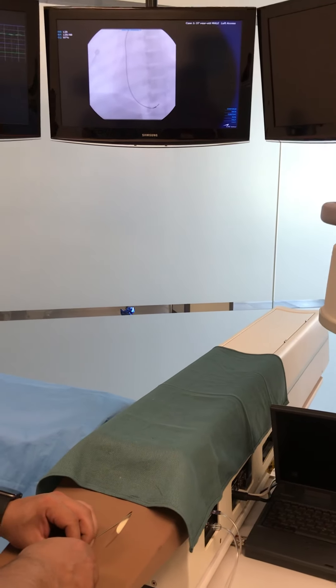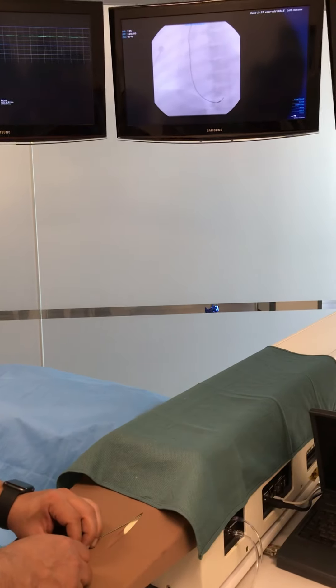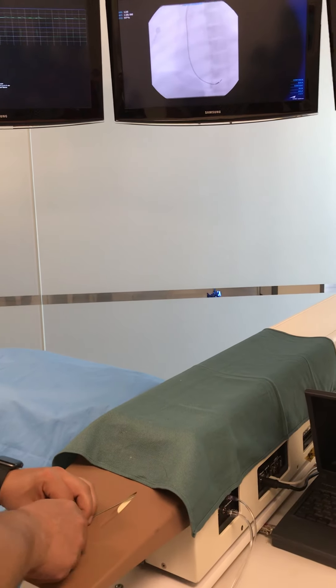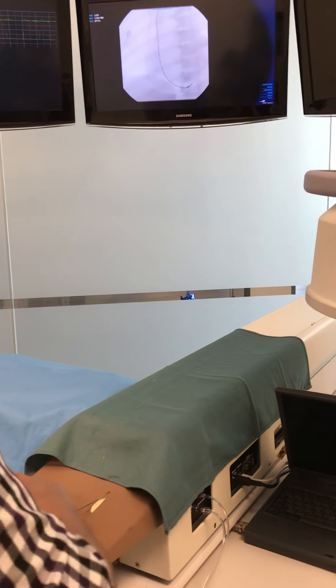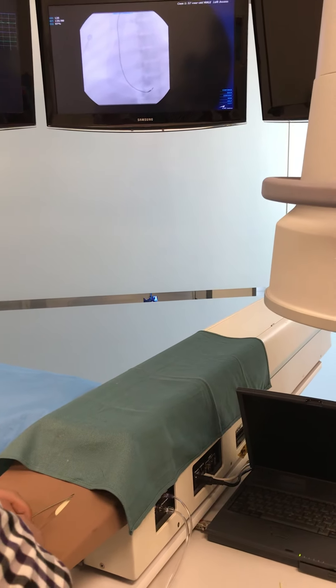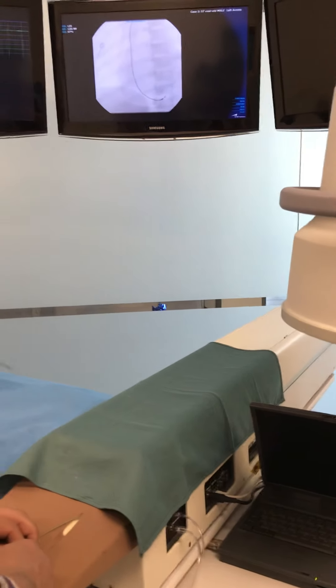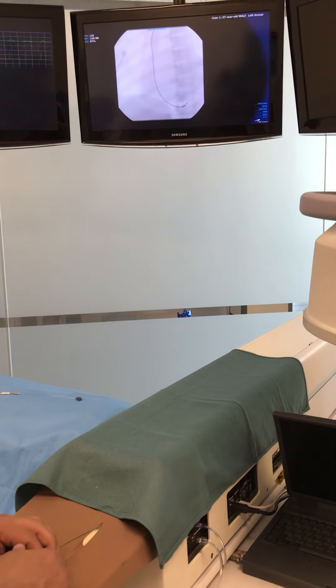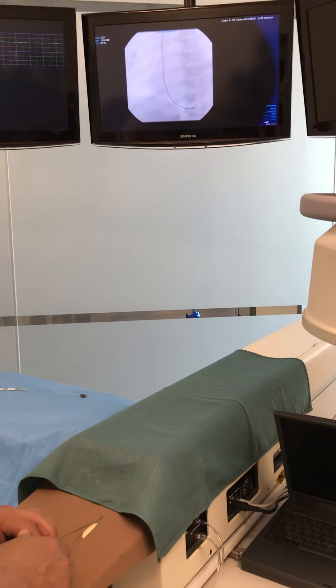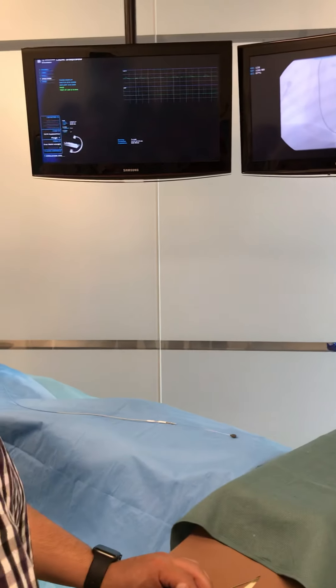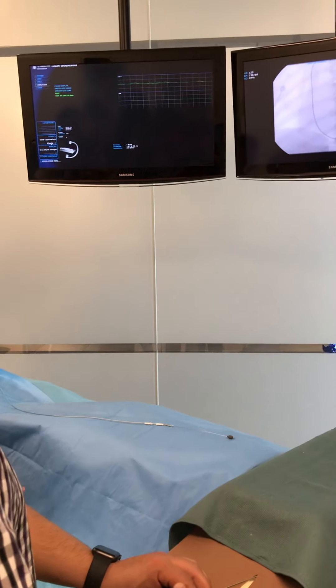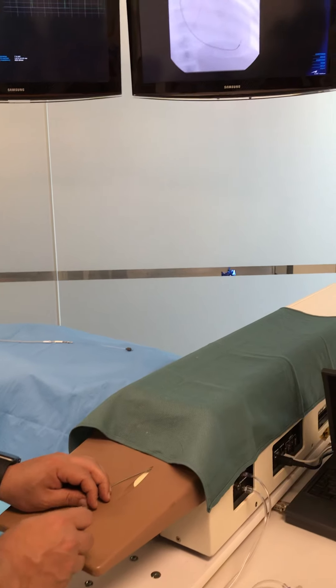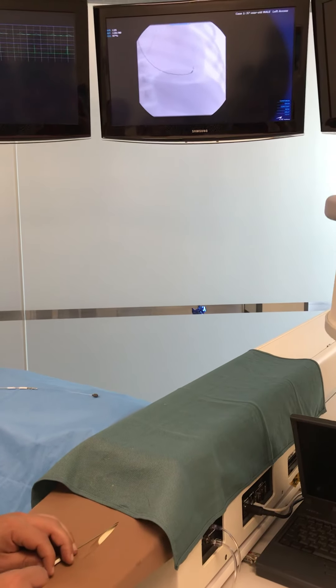So it'll get an arm over here. Normally what we do is we take that little pinch-on tool, we connect it to the pin here, and we rotate. Well, the simulator doesn't know that, so we have to fake out the simulator. I'm going to tell the stylet to be the fixation device. Come on, fluoro. Yes, we are.